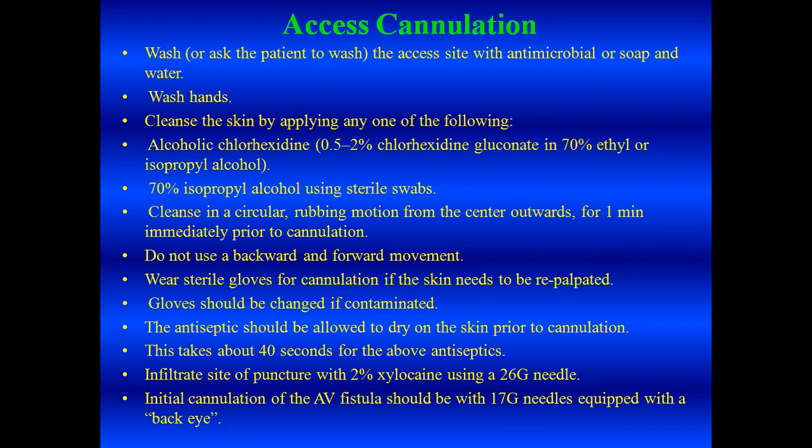You clean in with a circular movement. Change gloves if they get contaminated at any point of time. Most importantly, allow the antiseptic to dry on the skin, which means about 40 seconds for alcoholic chlorhexidine or isopropyl alcohol, whereas betadine, povidone iodine, takes about 2 minutes to dry.